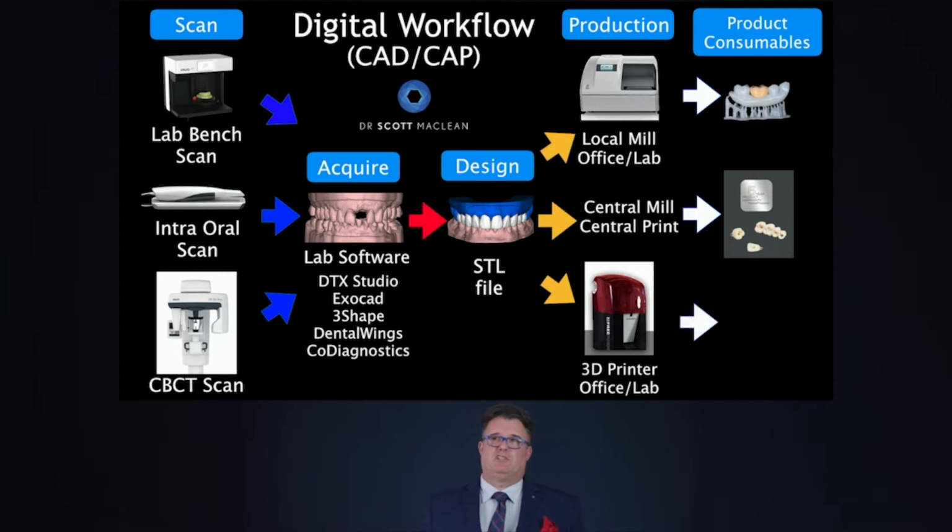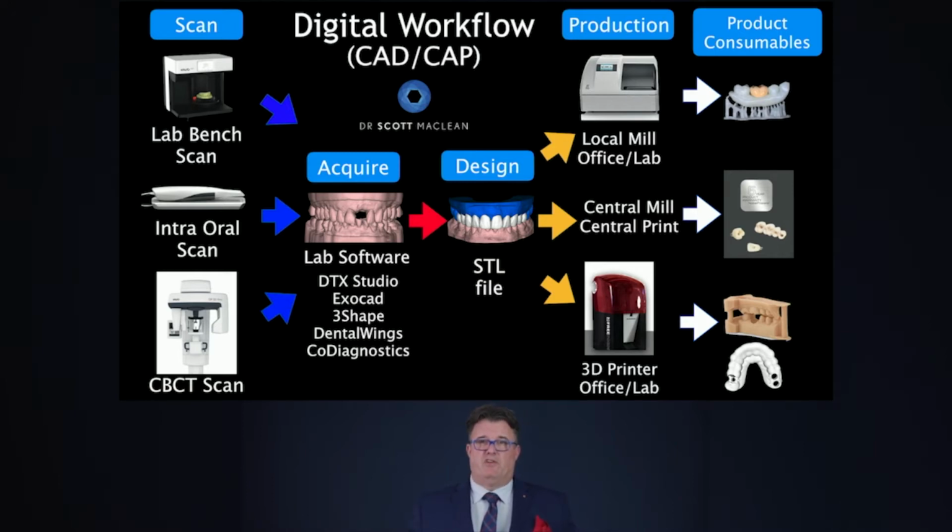So when you're doing this, you're actually going to print maybe a model, and/or you may plan to have some type of implant stent to make having your implants go in a little bit easier. By doing so, we're able to print right away, very accurate and very perfect, and this is what we want: accuracy and precision.